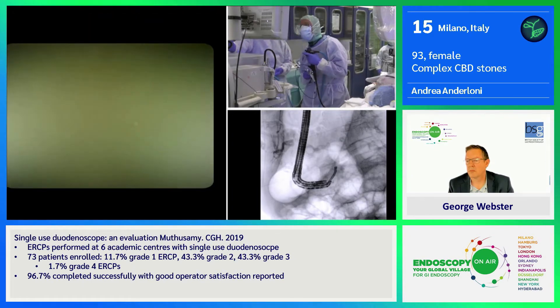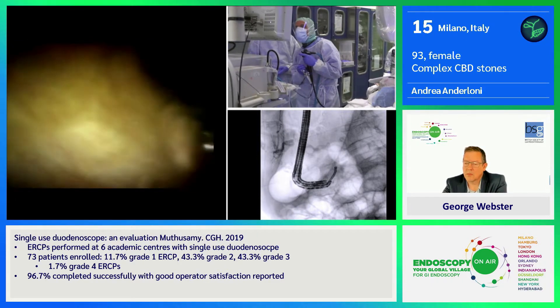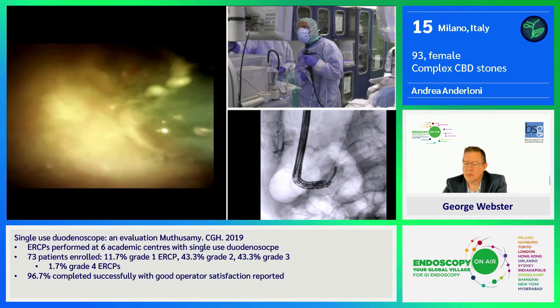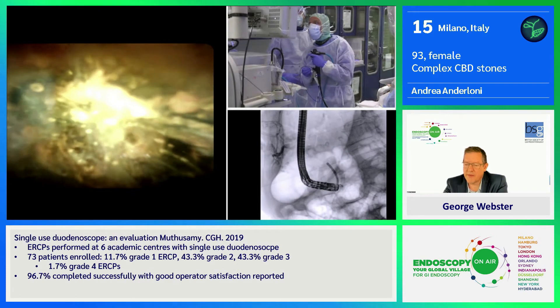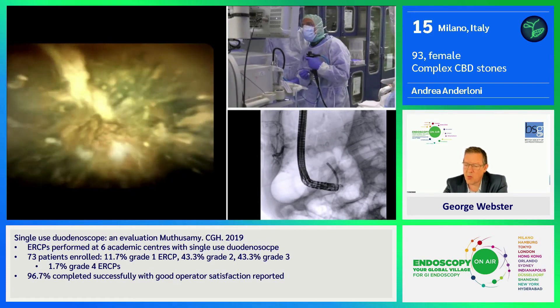With the Spyglass visualization, I can show you that now we are inside the bile duct. There is a very nice view of a stone that is maybe a little bit more distal than we were expecting.